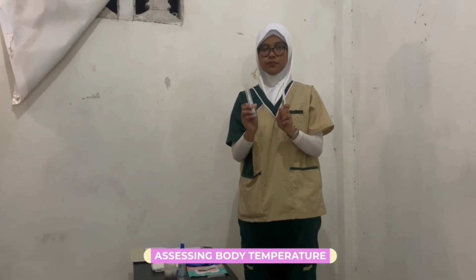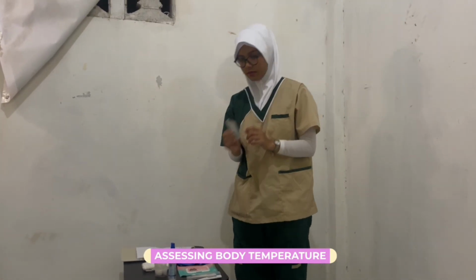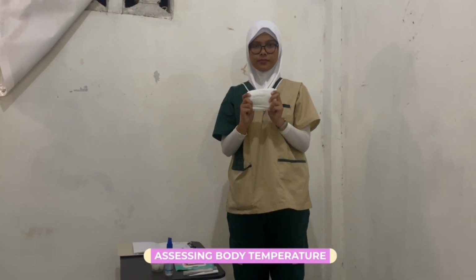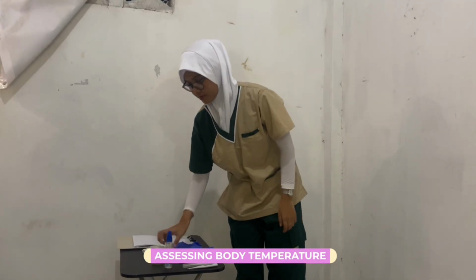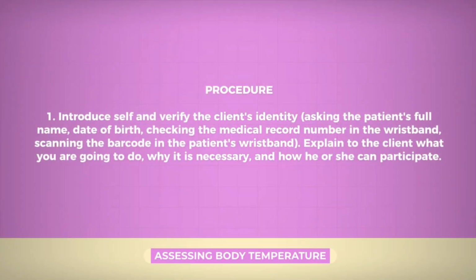Next is to assemble the equipments. We have thermometer, thermometer sheath or cover, water-soluble lubricant for rectal temperature. Disposable gloves protect both the nurse and the client, towel for axillary temperature. Next, tissues or wipes. Cotton balls, both wet and dry. Alcohol.